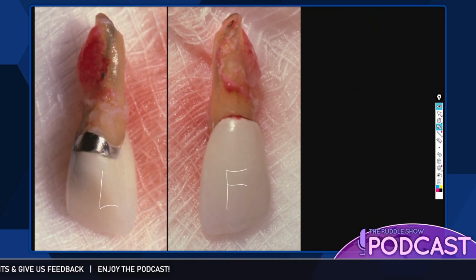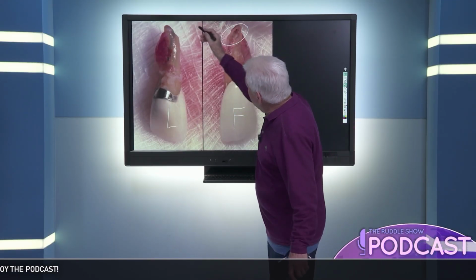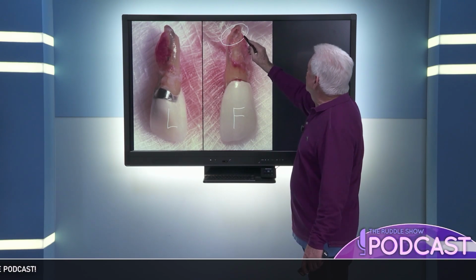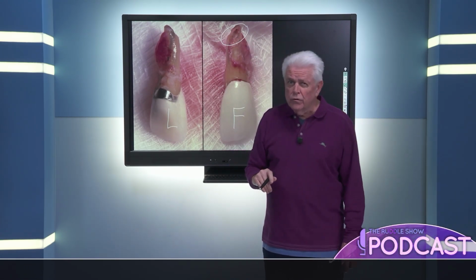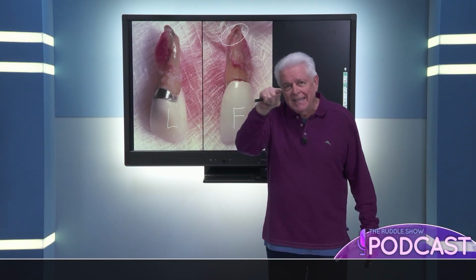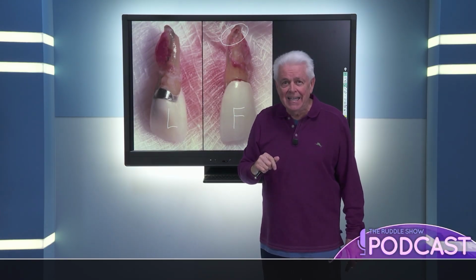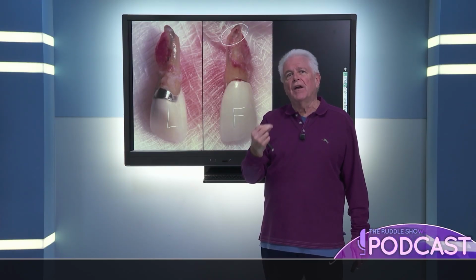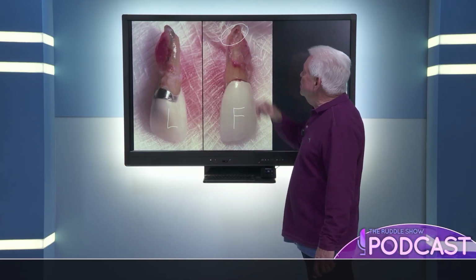And I want to bring your attention to this. I just beveled the root, and I beveled the root angled like that because that's the part of the root that faced the lesion. Remember, the lesion was lateral. So if you look carefully, does everybody raise your hands? I can see every one of you through AI. Do you see the black delineated mark around the pink gutta percha? That's leakage. That is stuff and breakdown products, okay? So it wasn't sealed apically.